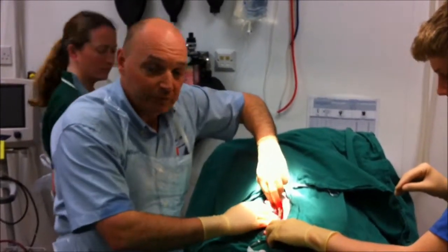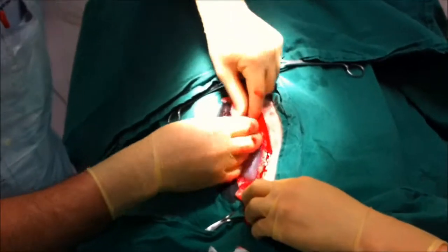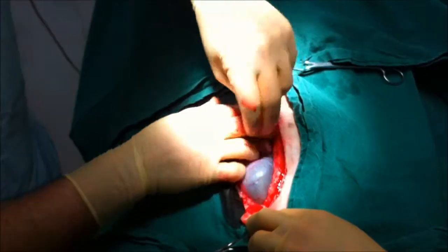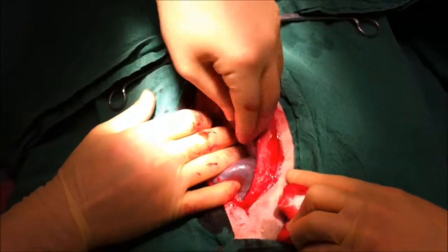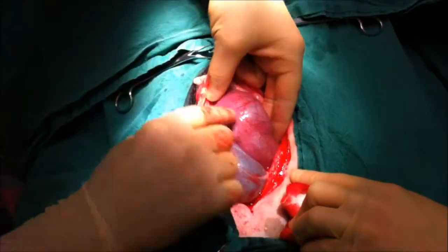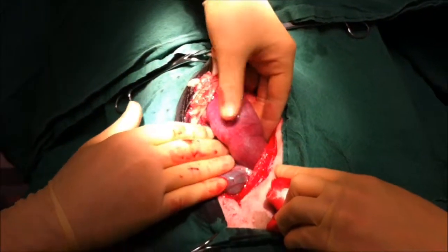We've just opened up the abdomen. This is her bladder sitting here — it's quite full. There's a little bit of intestine here, and then over here, this swollen part is her uterus, which is infected and will be full of pus, so we have to do a hysterectomy to remove all of that.